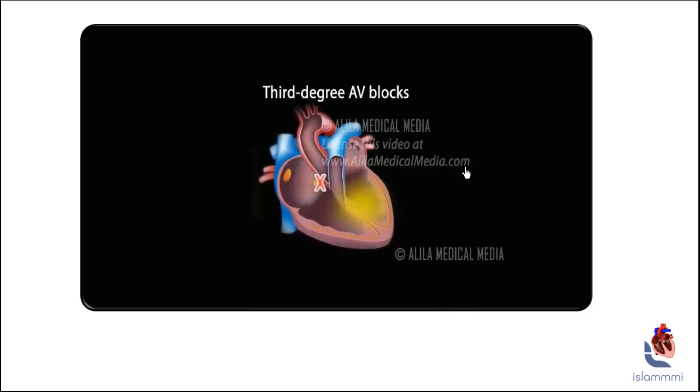So it's totally dissociated. Here the SA node is only activating the atrium and nothing is crossing. There is a complete cut here. A third degree or complete heart block means that no impulse will be able to cross.